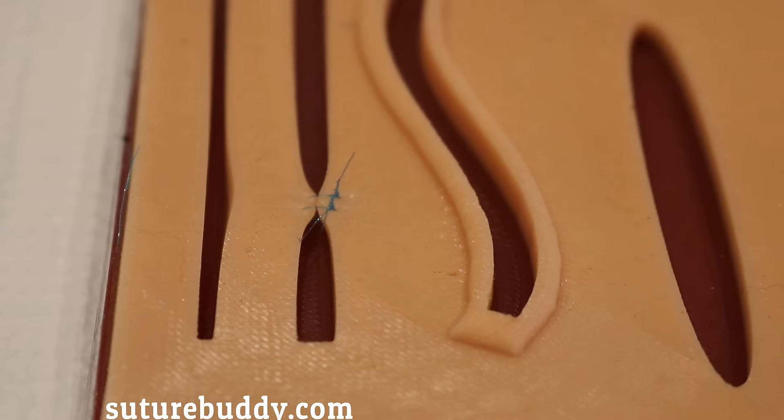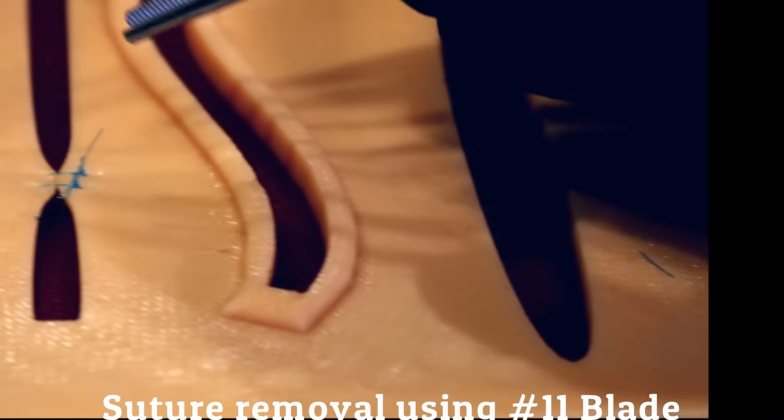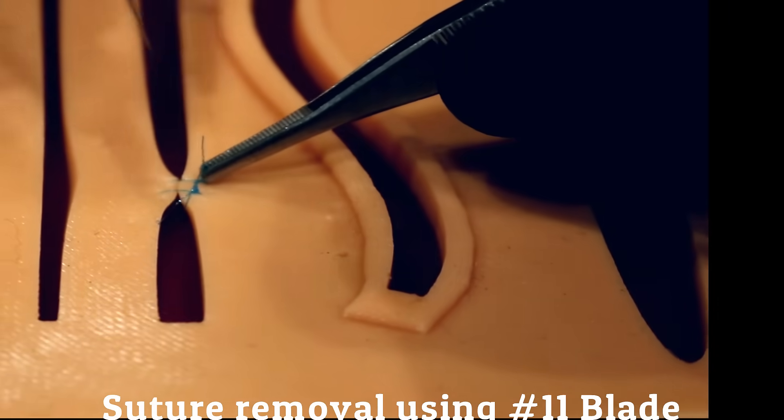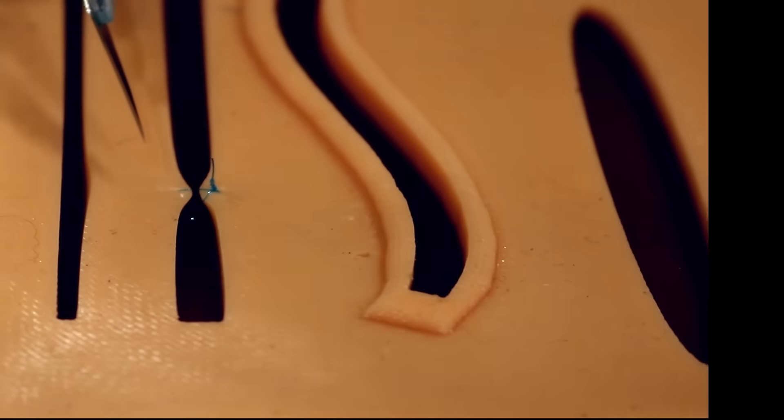Here we go, this is a close-up zoom of two simple interrupted sutures. So grab the tail, you see that, lift up and the sharp end, nick, real easy. They come right out. I'm going to do that again.